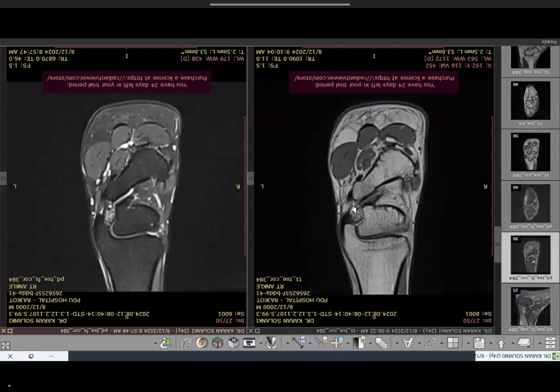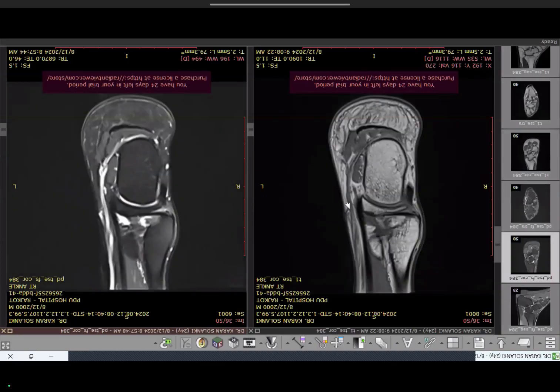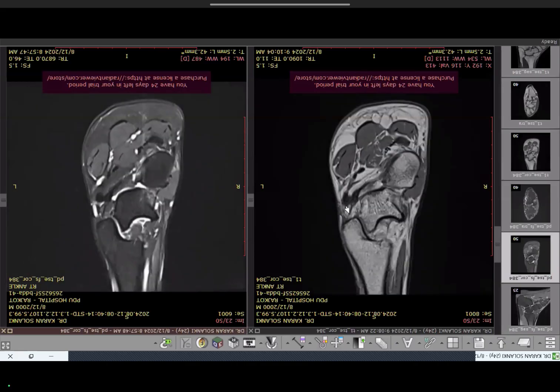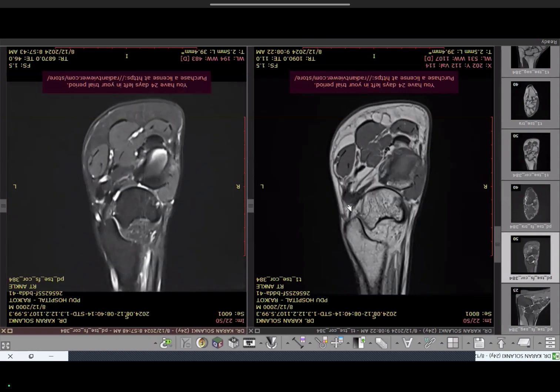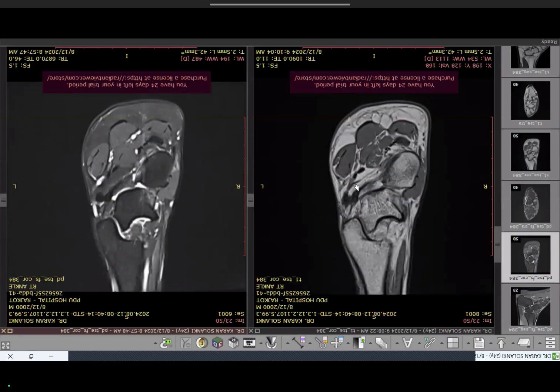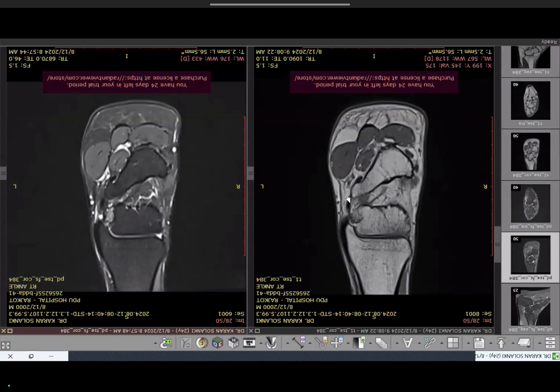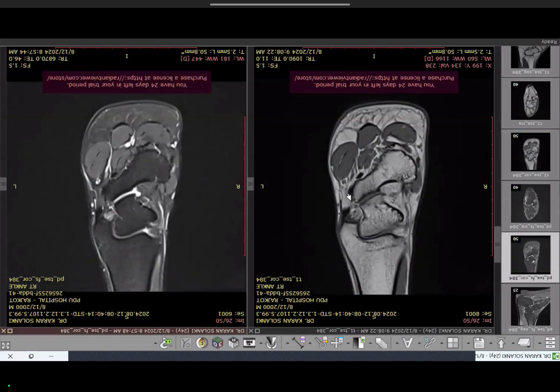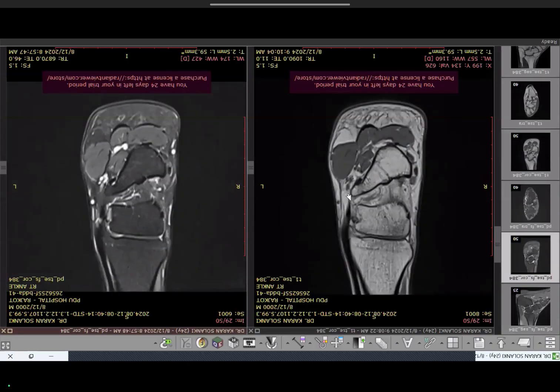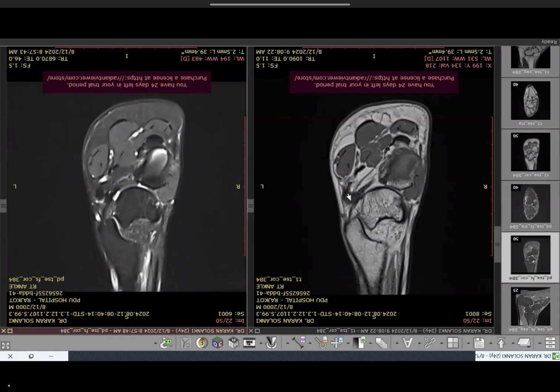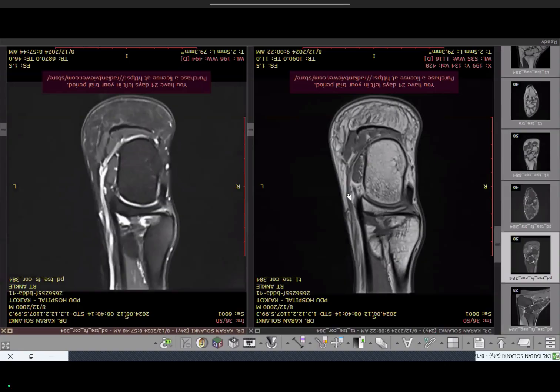Coming more anteriorly, you see a thin ligament arising from the medial malleolus attaching to the spring ligament — this is the tibiospring ligament — which forms a sling on which the head of the talus rests. This is the supramedial calcaneonavicular or spring ligament. The tibiocalcaneal ligament is also seen here as part of the superficial deltoid. In the lateral compartment, now visible in coronal, is the calcaneofibular ligament, which we did not see in axial or sagittal.